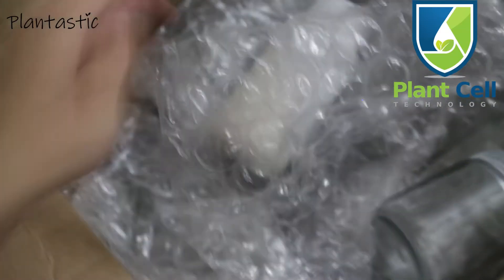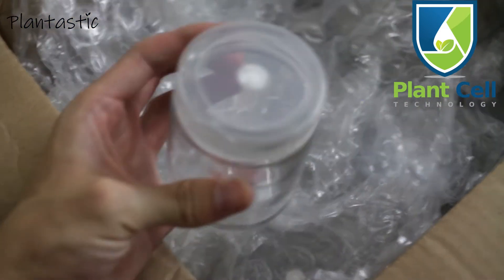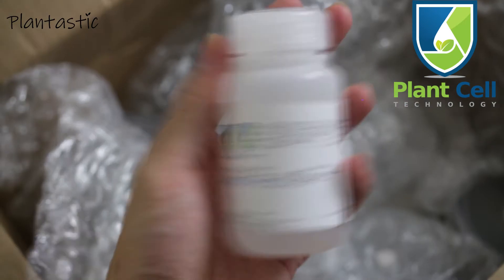So let us see how many different colors are around. Now we can see what is inside.